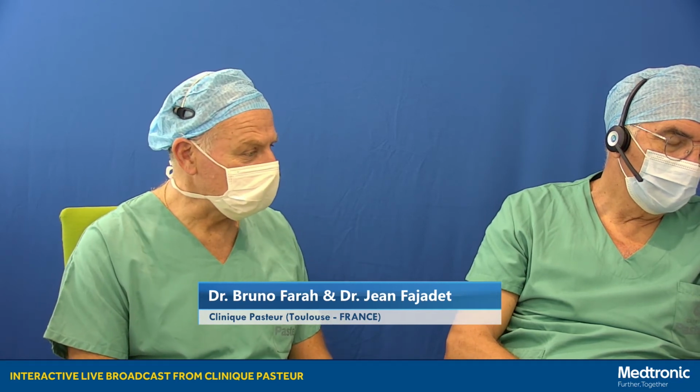There's a question, Jean. Was it acceptable to stop after LAD stenting and POT, without fenestrating the stent to the diagonal? I think that the angiographic view showed that there was some degree of narrowing at the level of the ostium of the diagonal. It was quite a large branch. Probably if it was a less important branch, we would be more conservative.